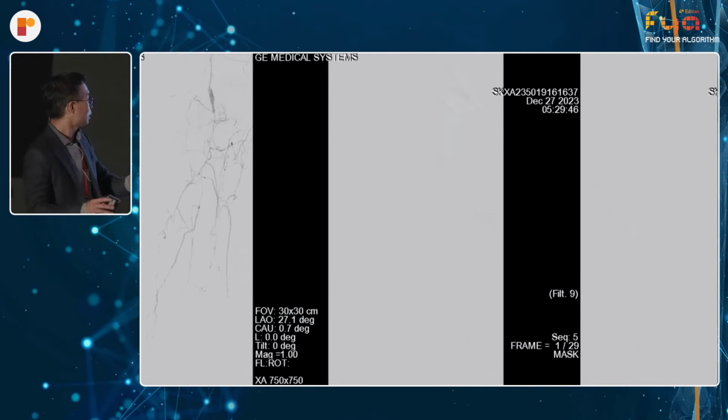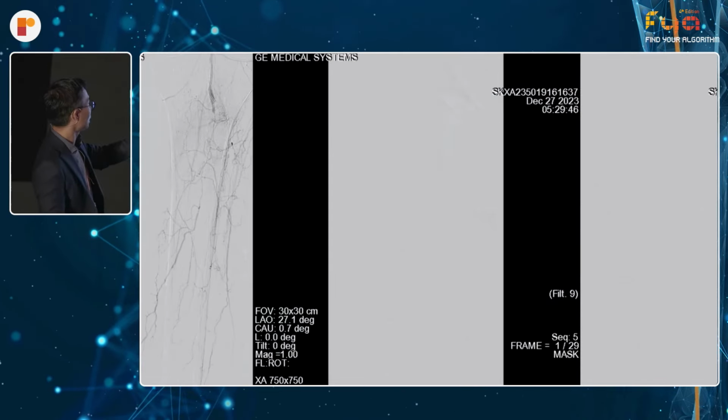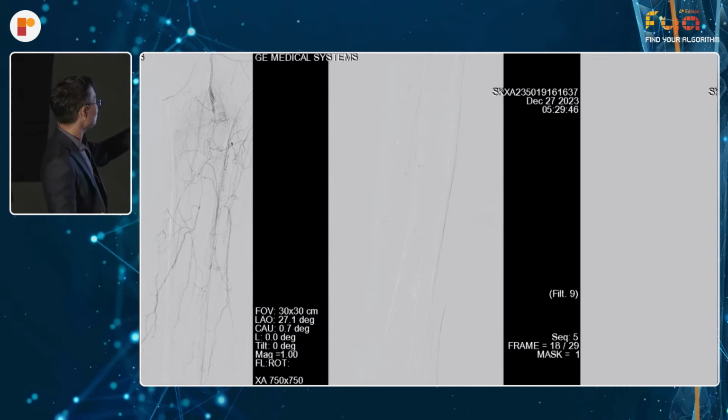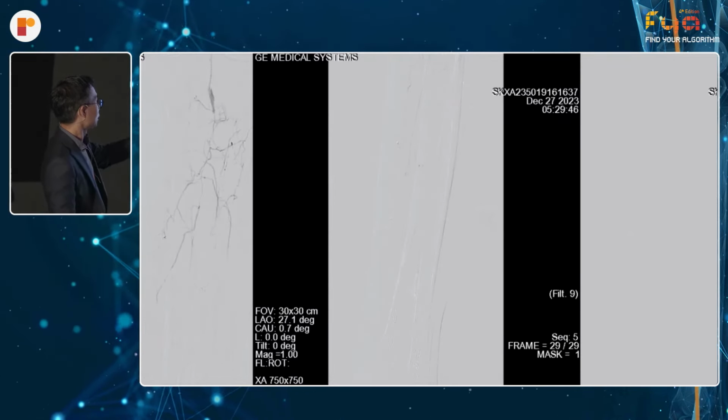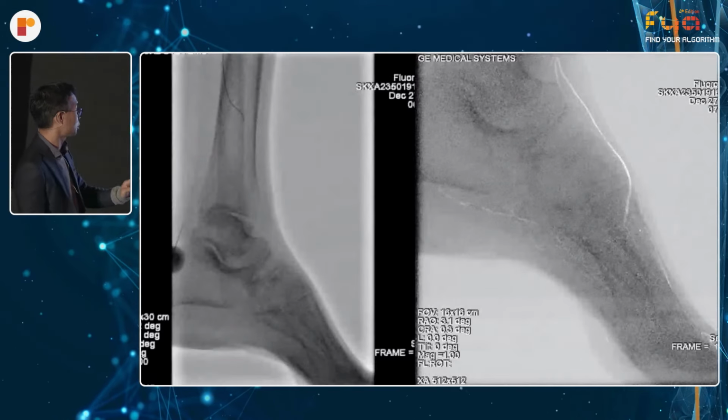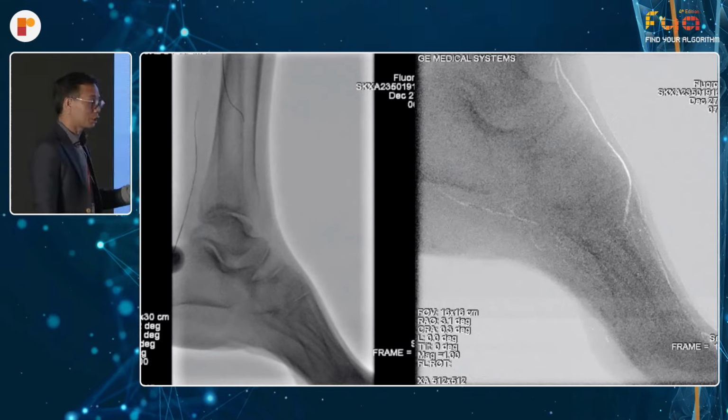So really, on to the last case now. I realize my time is short. Sometimes you get cases like this where you've got nothing. It stops in the TP trunk. You've got no idea which arteries are which. So the pedal plantar loop approach here is absolutely essential in this kind of instance.